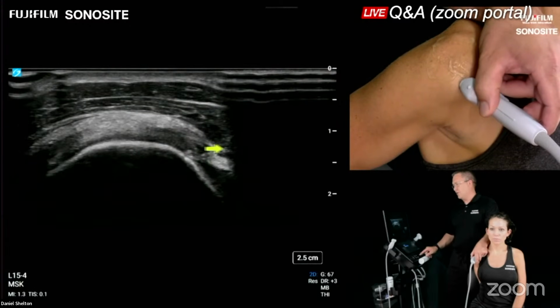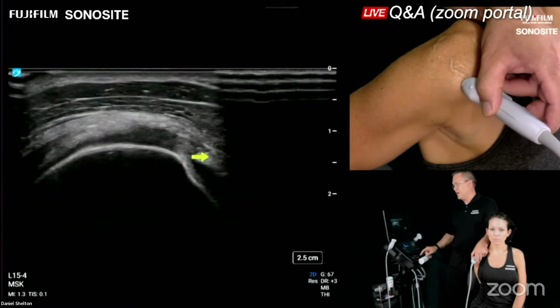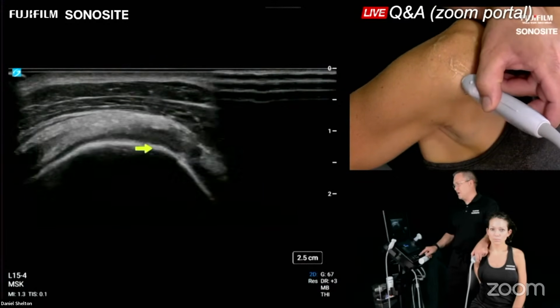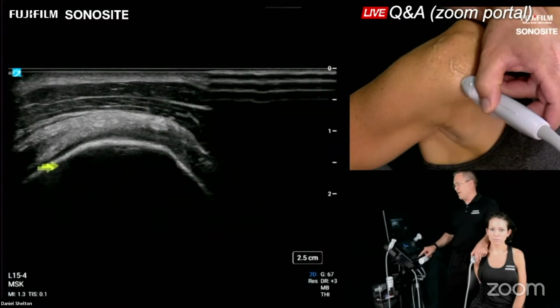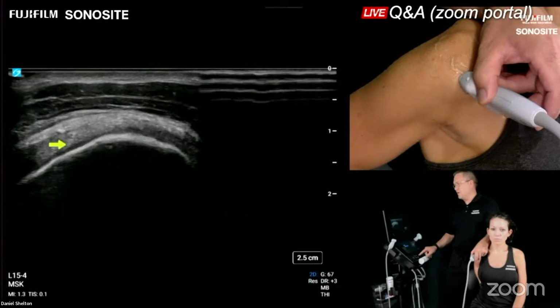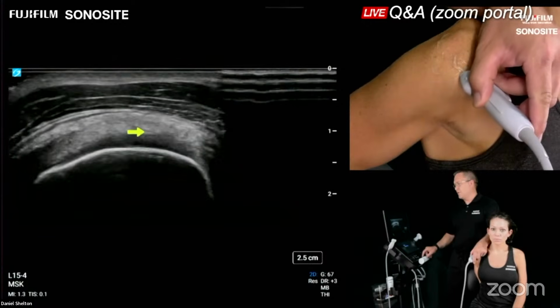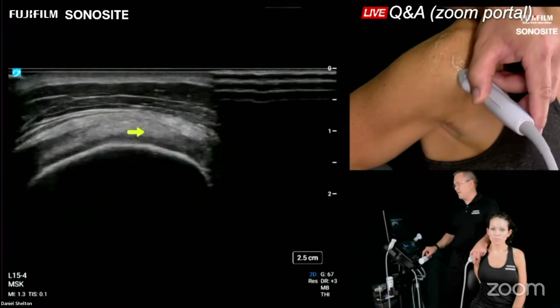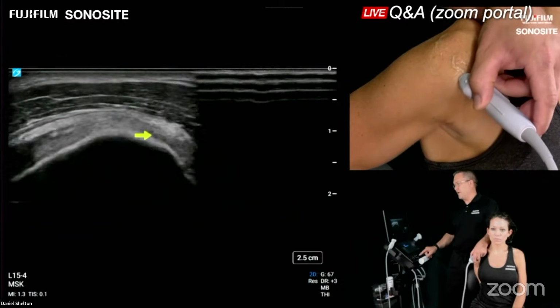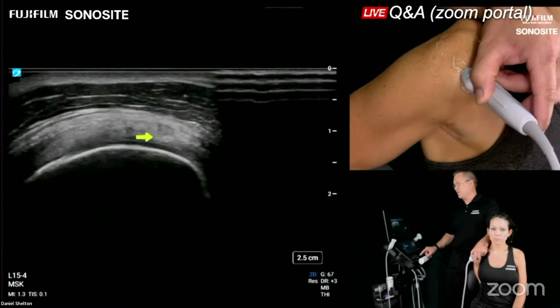Here's our biceps anteriorly to make sure that we're not losing our spot, our lighthouse. And then you can see that anterior or superior facet right here, as it's called, of the greater tuberosity, that bony apex we saw in the anatomical diagram. And you can see the infraspinatus back here, jumping over about a third of the supraspinatus's posterior margin here. So we're going to sweep up and down that footprint right here, and we're going to just be evaluating that leafy, feathery edge of the supraspinatus, and using sometimes anisotropic artifact to our advantage.